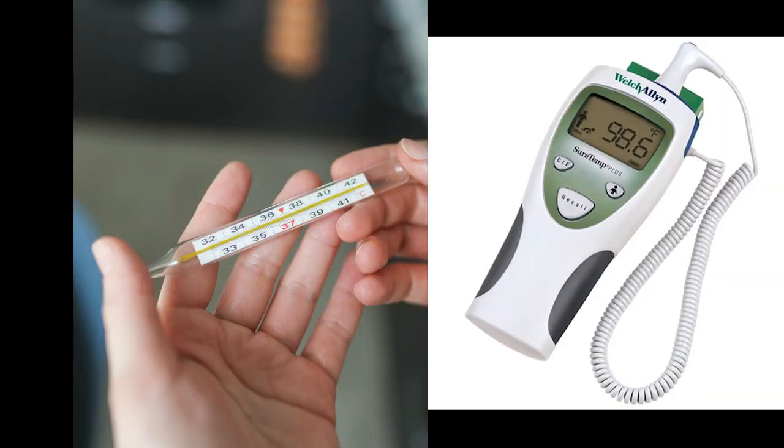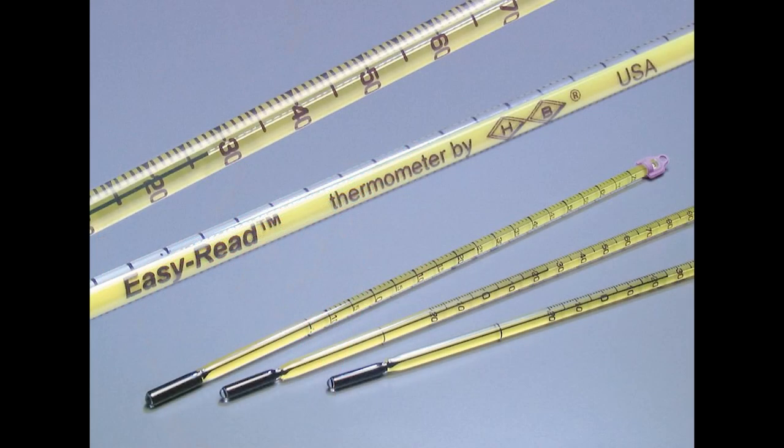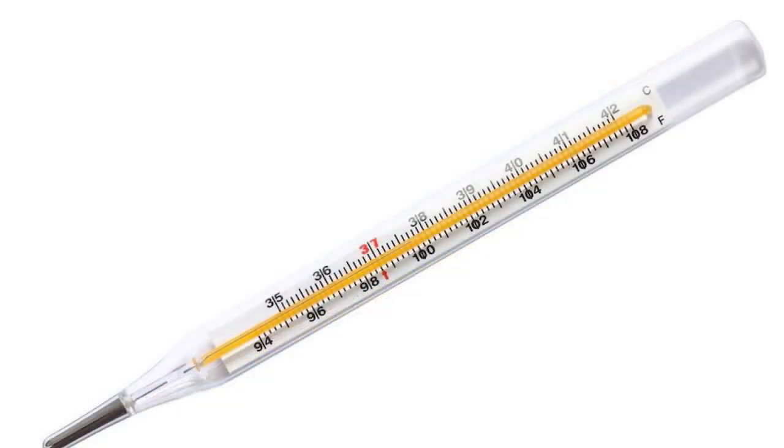There are two main categories of thermometers: analog and digital. Most analog thermometers use mercury or, more commonly, alcohol against a stationary scale. The mercury or alcohol expands at a very specific rate proportionate to the increase in temperature.